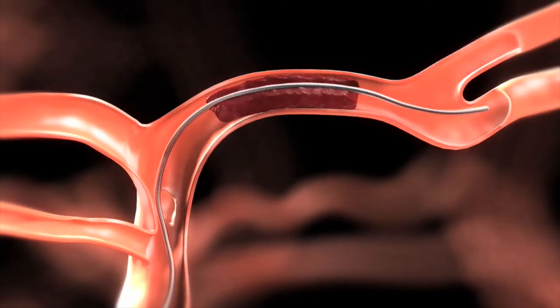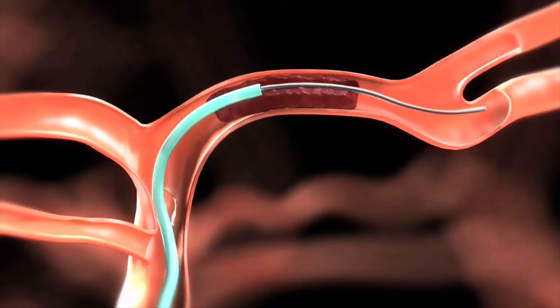We bring up our microcatheter all the way up into the middle cerebral artery in the brain and cross the blockage.